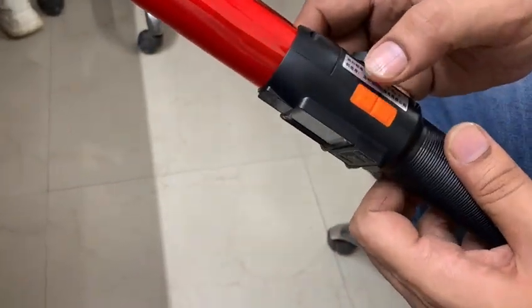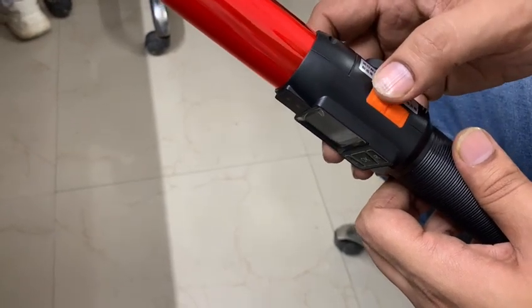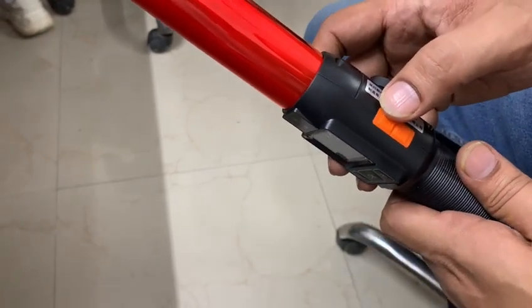There are two buttons — one for the torch and one for the flash. For the torch, you have to press this button for 2 seconds.